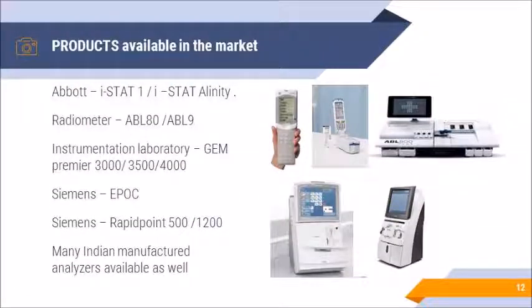Products that are available in the market. Many multinational companies are providing great healthcare products: Abbott, Radiometer, Instrumentation Laboratory, Siemens, and many Indian manufactured analyzers are also available in the market. Depending on your utility, your need, as well as your finance priority, these products are chosen. The most important criterion to keep in mind is service availability. You should see to it that you have great service in your area and vicinity.